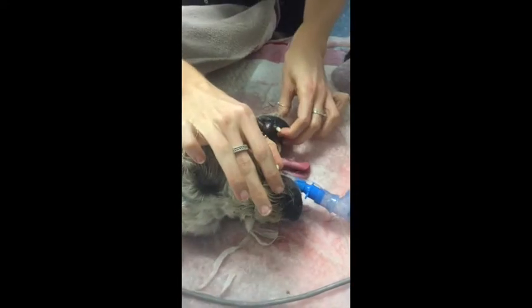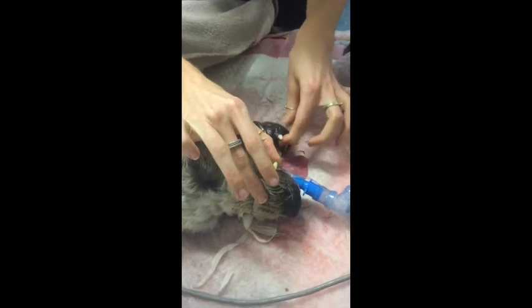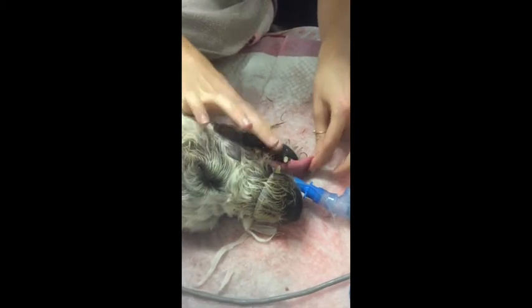In checking jaw tone, we want to make sure that it loosens, offering only a light resistance when pulled, allowing staff to easily maneuver it for intubation and throughout the surgery. Cats will require a local anaesthetic throat spray before intubation, but as we can see, this patient has already been intubated and their jaw tone is nice and loose.